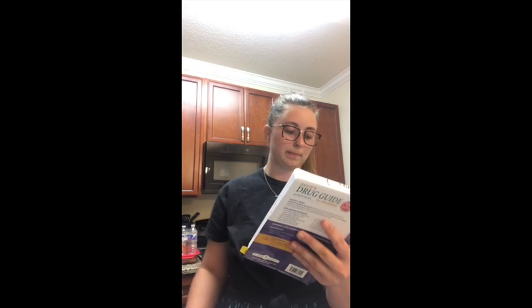I will administer this into the middle of the outer thigh. And for most medications, you do not massage the site of injection, but specifically for this one, in the book, it says to rotate the injection sites and also massage the injection site after administration to enhance absorption and decrease local vasoconstriction. Some education for my patient: instruct him to alert a healthcare professional if he experiences shortness of breath, diaphoresis, dizziness, palpitations, or chest pain.